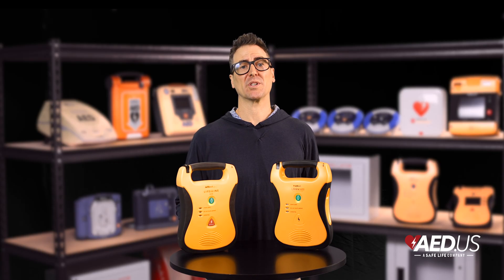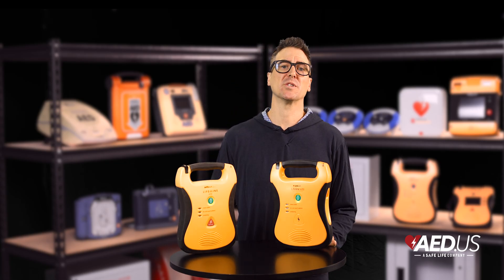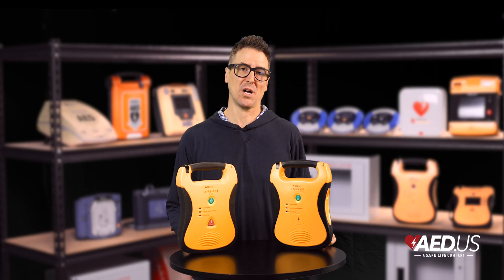It can deliver up to 300 shocks for 16 hours of continuous operation, making it dependable for extended use in emergencies. This longevity not only enhances performance, but also reduces maintenance and replacement costs over time.